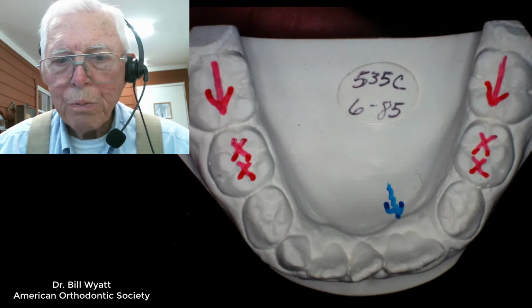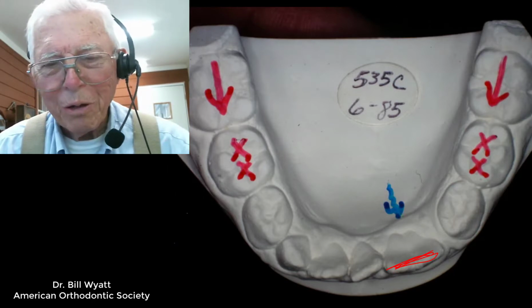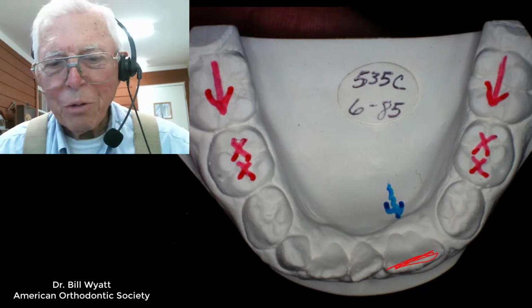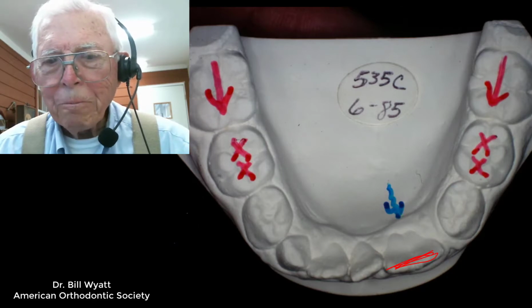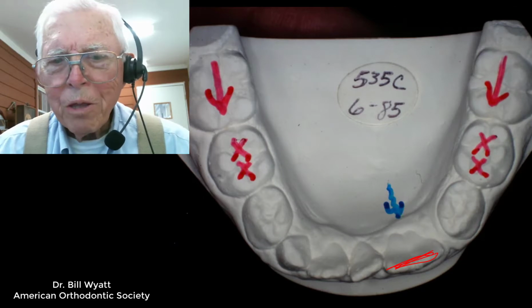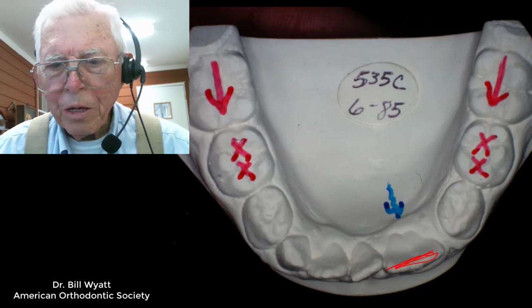Now the lower arch was spread out, and he also has a fused tooth together down here. So it's a stack of problems in the case, and you're going to get cases that have a whole group of problems, and you can have the same situation come up where you'll only have one or two problems, and you'll still have to change the facial structure in here. So let me get on with it.